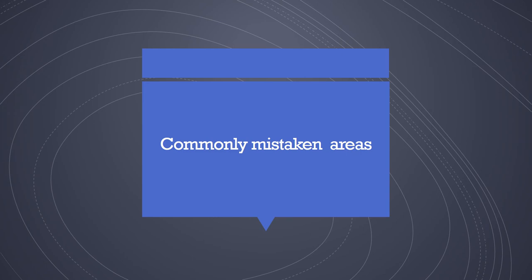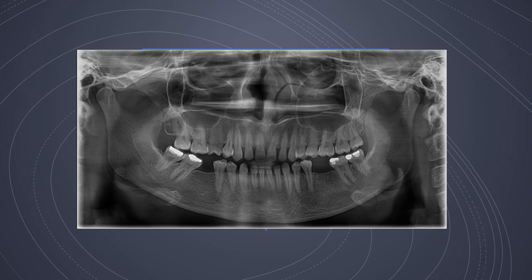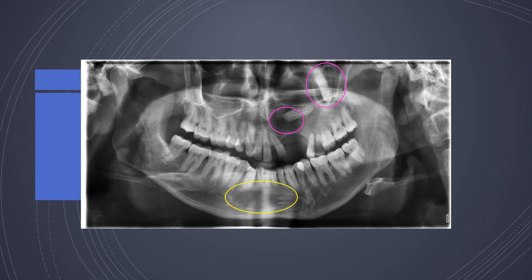Let us look at some commonly mistaken areas. This panoramic radiograph shows a very prominent air shadow — probably blood vessels within the sinus and nasal region. The area highlighted in yellow should not be mistaken for a radiolucency. Also, while concentrating on the impacted canine or lateral, one can totally overlook a tooth impacted high up in the maxilla. This is why it is important to pay close attention and spend time systematically diagnosing the panoramic radiograph.